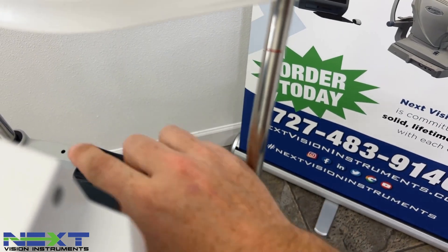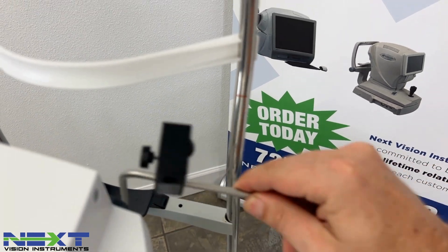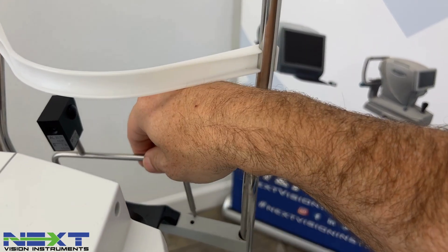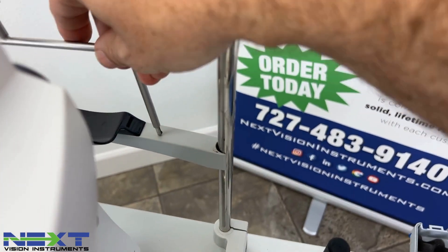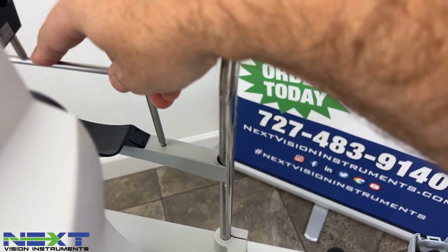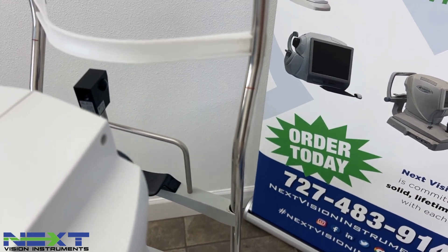There's a hole here and on the other side — the test eye will just fit right down into the holes, snap into place, and it's sitting there like a patient.